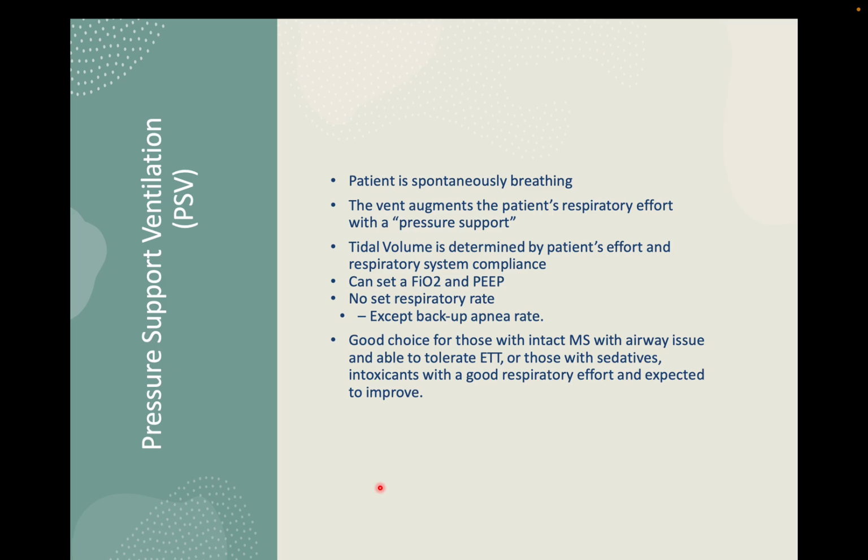If you put them continuously on assist control ventilation only, the respiratory muscles don't require any effort, as the mechanical ventilator continuously delivers the breaths, so respiratory muscle atrophy, like paralysis, will occur. That's why after 2-3 hours or so, you need to put them on SIMV and check how many breaths the patient is able to generate, and how much effort the respiratory muscles are able to put in to generate the breath.